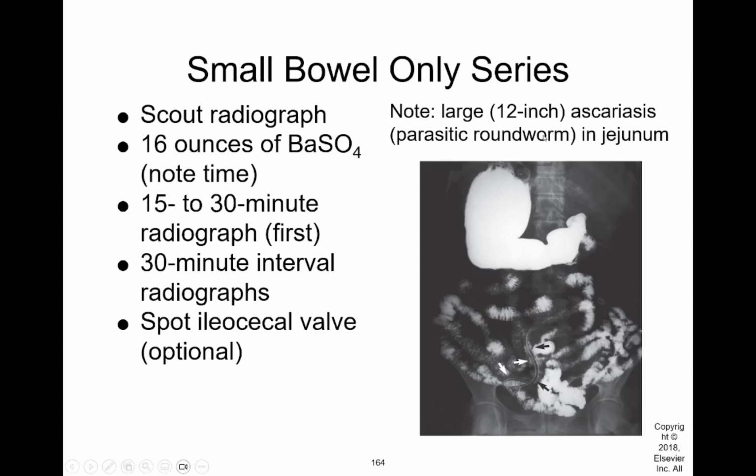So this one is kind of interesting. What we've got is a parasitic roundworm, and that's that thing that we're seeing right there. So that's probably the cause of this patient's discomfort, is they've got a great big roundworm. Probably a lot of cramping there.